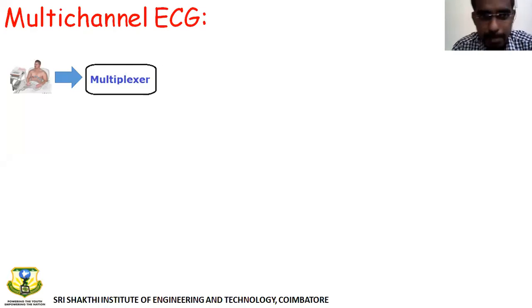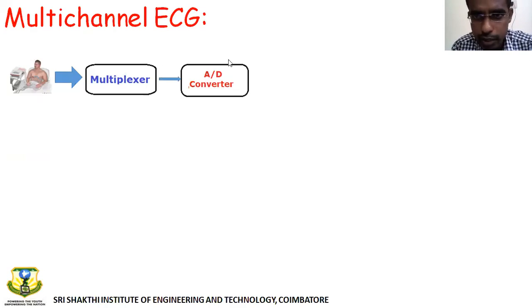Okay, so multiplexer means many to one, right? So many inputs. Even in digital electronics, they would have taught you in 4th semester, right? So many channels are brought to a single channel. Like something similar to your cable television. If you turn on, there are simultaneously channels going on at a time. You see one. So the channels are frequency division, frequency is divided into scales and it is being multiplexed. So similarly here, the number of leads is being multiplexed and it is being given to the A to D converter.